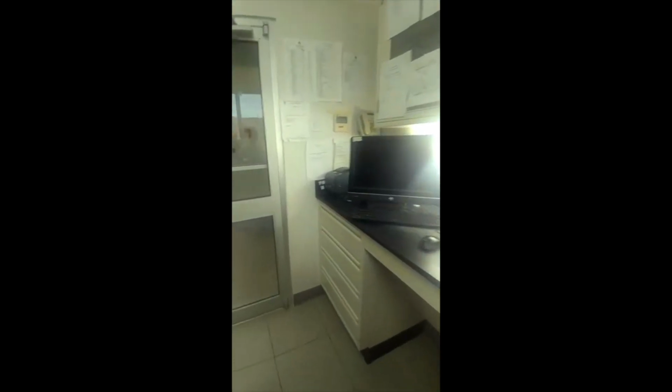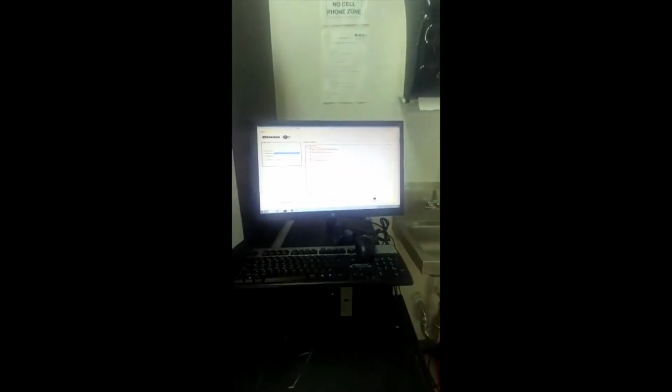So all of the reading of the plates and the resulting is done on the computer through our laboratory information system. It makes the system more efficient, and so we're able to get reports, send them out to the ward without having to print them and so on, in real time.